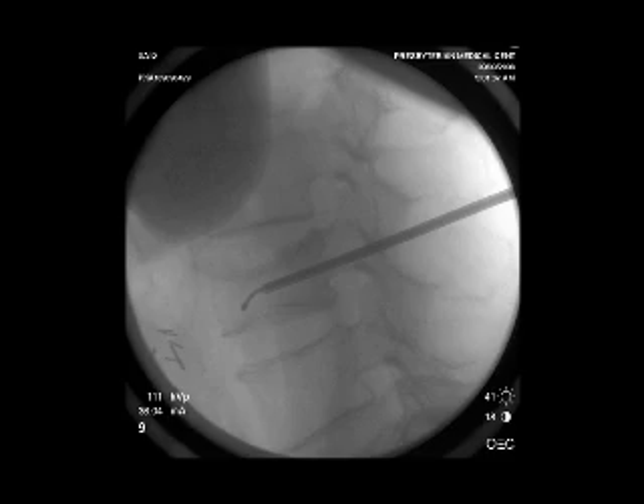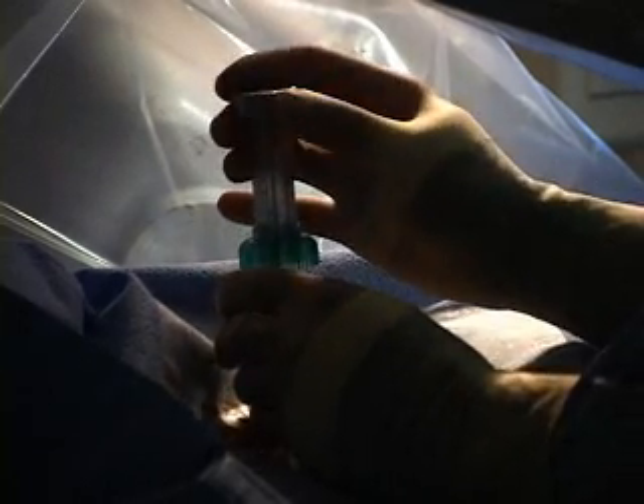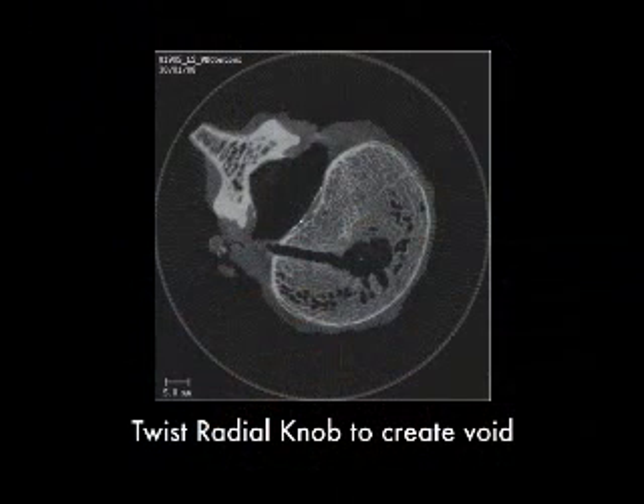Much of that right hemivertebra is basically obliterated by this tumor process. I'm making my sweeps here. The space actually is pretty impressive.